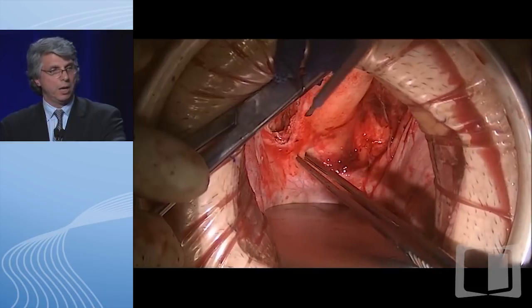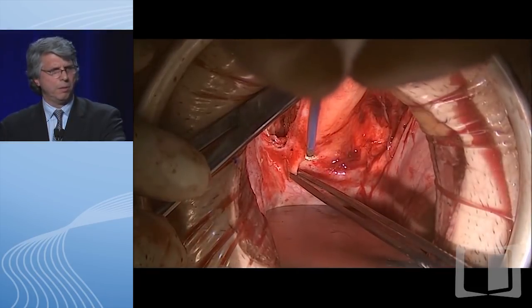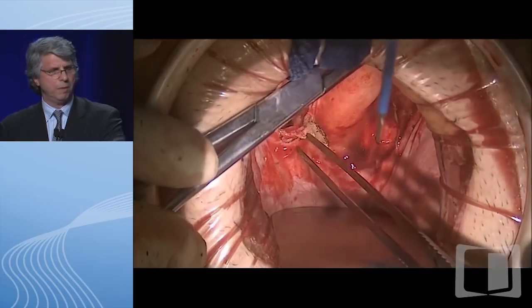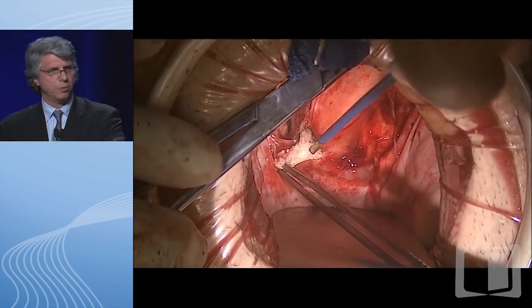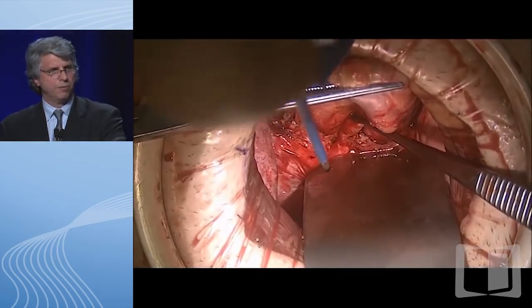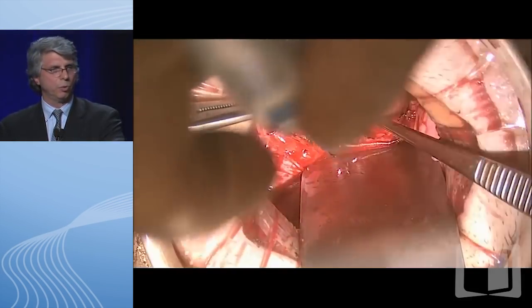We also go anteriorly, staying away. This was a male patient, so we stay away from the prostate in this particular situation. We continue the dissection circumferentially until the rectum is mobilized all the way down to the pelvic floor, and now we're getting ready to transect the rectum.